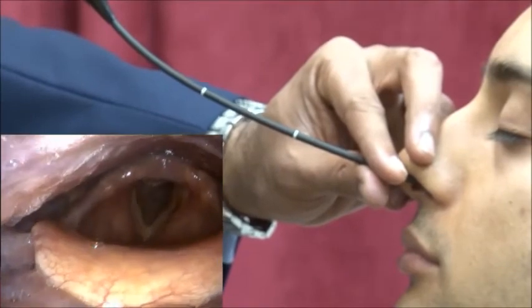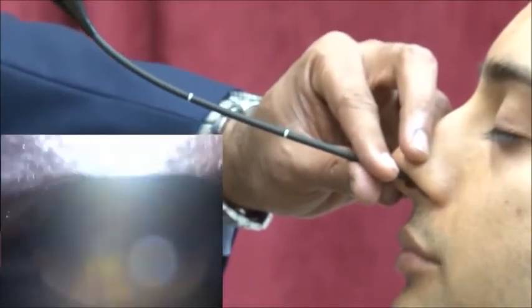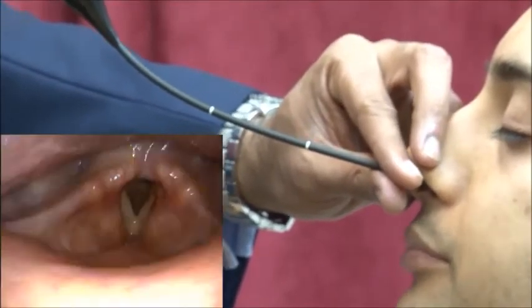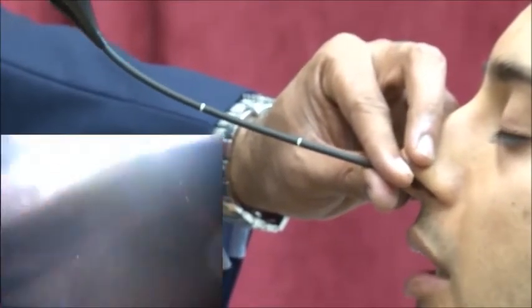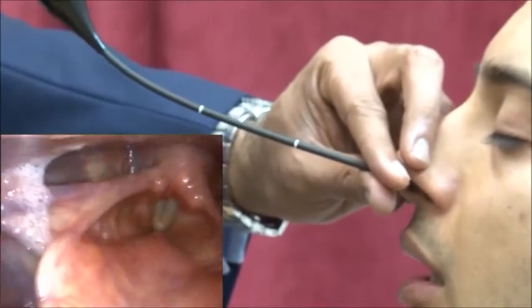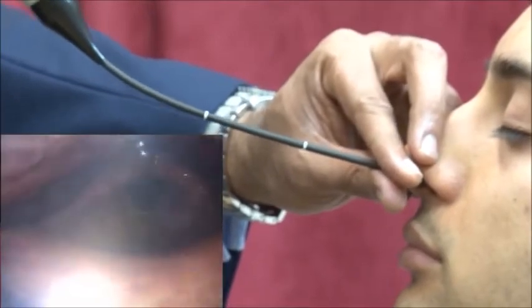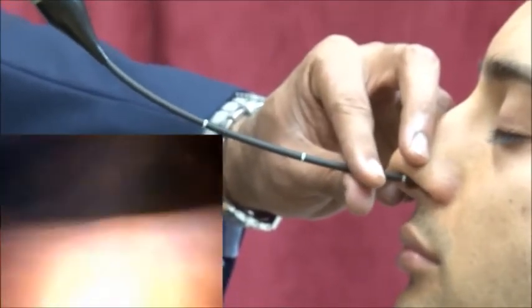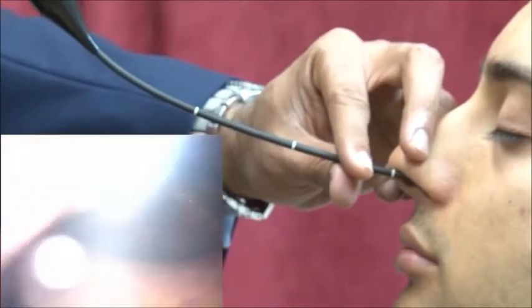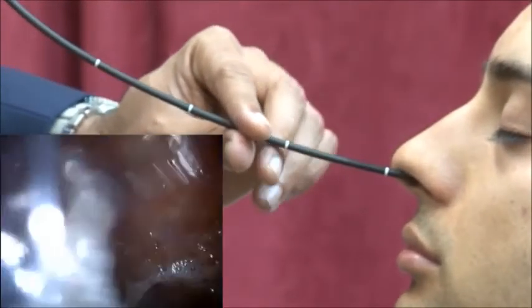And that's the larynx coming into view. You can see the arytenoids, the supraglottis. And Omar, can I please ask you to say E for me? E. And one more time, just say E. E. Excellent. And both vocal cords are fully mobile with no sinister looking mucosal lesions. That's just a little bit of saliva, which is always evident. And that's a completely normal nasoendoscopy of the larynx and pharynx.